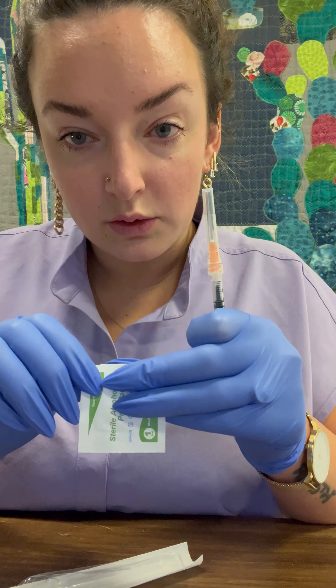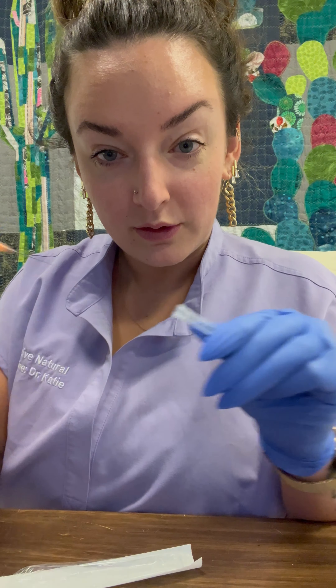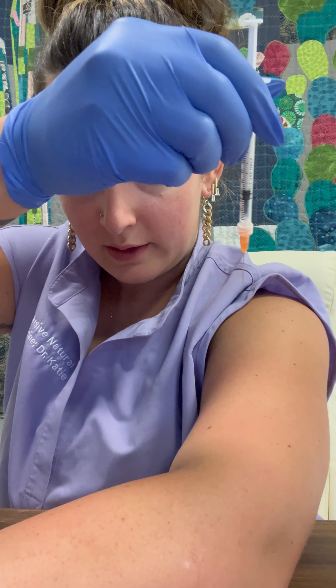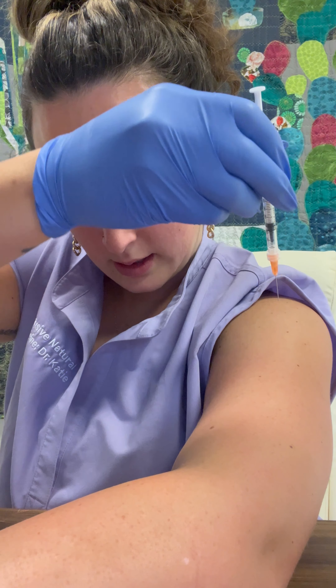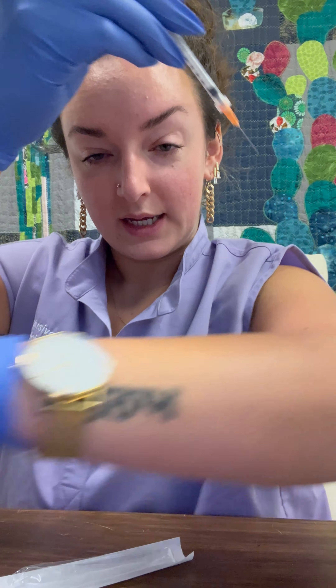You'll need an alcohol swab of course and you can swab the area. You'll remove it, but for video purposes, swab the area and then remove the cap. Easiest place to do it is your upper shoulder muscle here. Then you will poke through, press down the plunger for the testosterone to go inside the muscle, withdraw, and you're done.